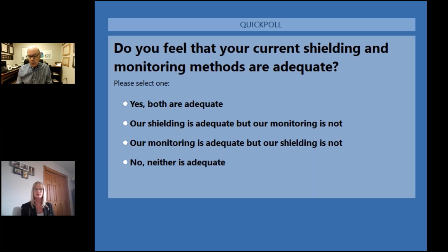First of all, they're highly correlated, and that's with scatter radiation. So energy levels in the 45 to 50 kV energy range, and down to a little less than 100 microsieverts per hour, and all the way up to a couple thousand. So the correlation was, I think, surprisingly high between all those. And then we looked at repeatability of the measurements, and the repeatability was also quite good.